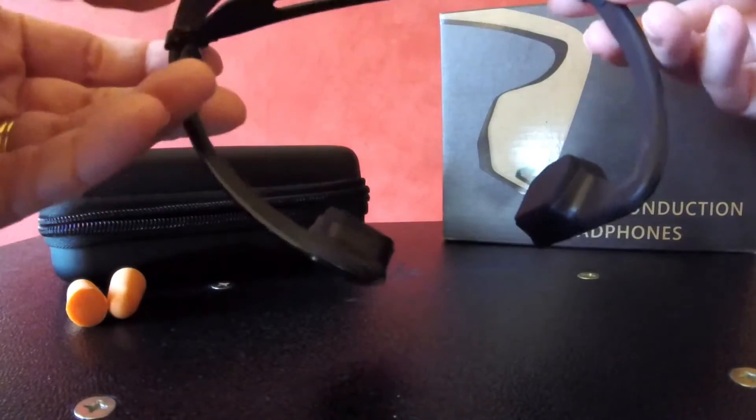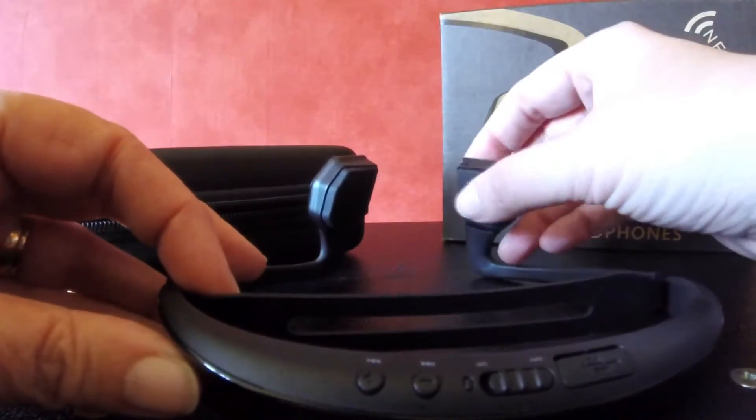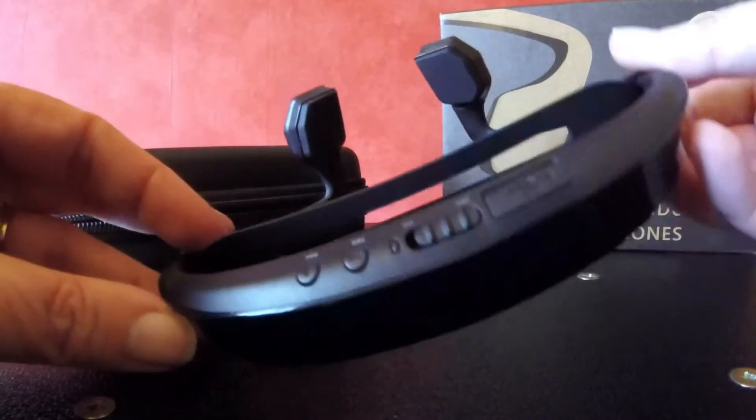This is a rather nice, comfortable headset. And those pads there mean you get good sound and more bass than most of these things provide.